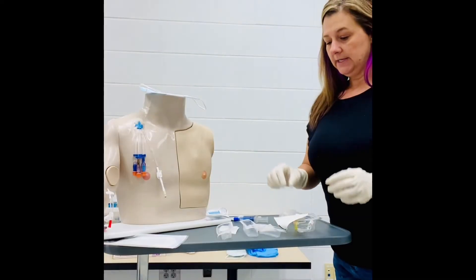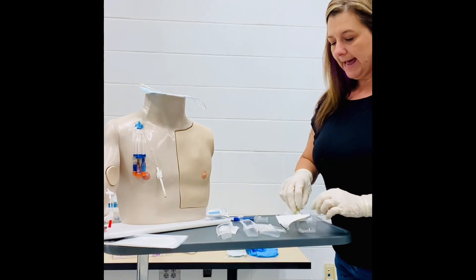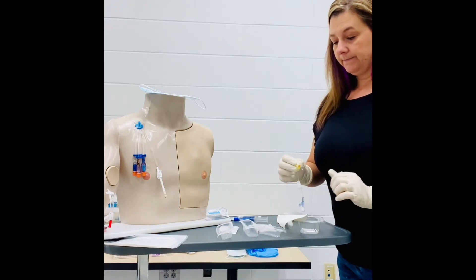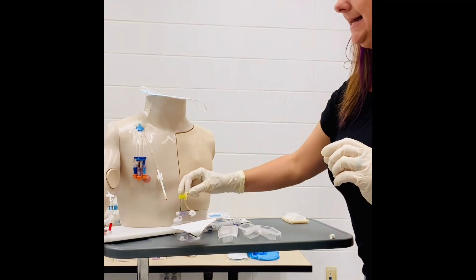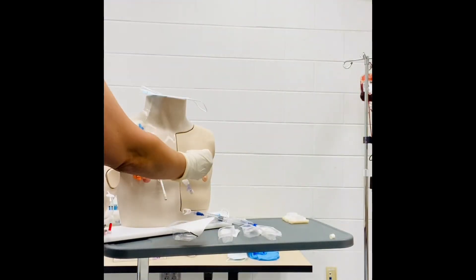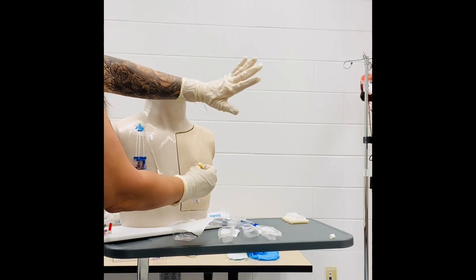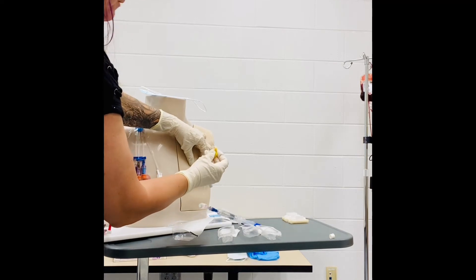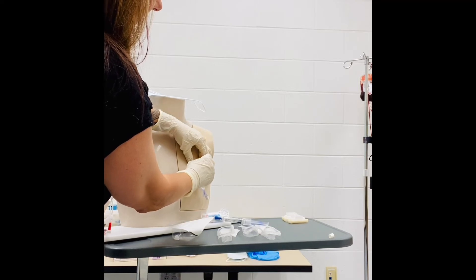Now we're ready to insert the needle. We can go ahead and pick this up and remove our cap — because we're sterile, the inner part of this is also sterile. Grab our Huber needle, maintaining sterile, and I'm going to move this way so that I can palpate the skin. We can take our left non-dominant hand and go ahead and stabilize the port, and we're going to take the Huber needle and slowly insert that into the port cap.